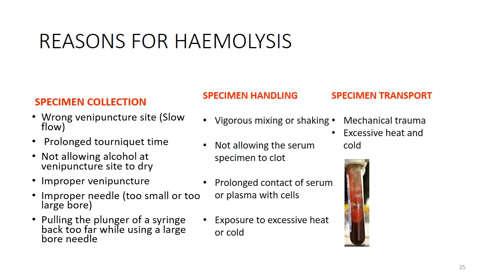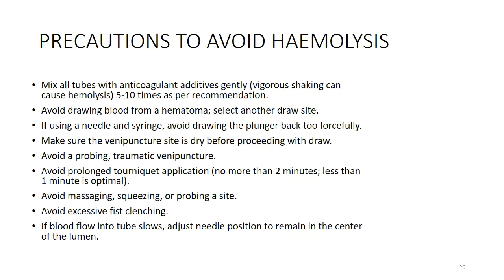So these are the precautions to avoid hemolysis. Mix all tubes with anticoagulant gently. Avoid drawing blood from a hematoma; select another draw site. You have to use the proper bore needle, and make sure the venipuncture site is dry. Avoid excessive probing, fishing, and traumatic venipuncture. Avoid prolonged tourniquet application. Excessive massaging, squeezing, and probing a site is not allowed. For fist clenching, you can just ask the patient to clench his fist for prominence of the vein. Once the blood starts flowing, immediately advise the patient to slowly release the fist.